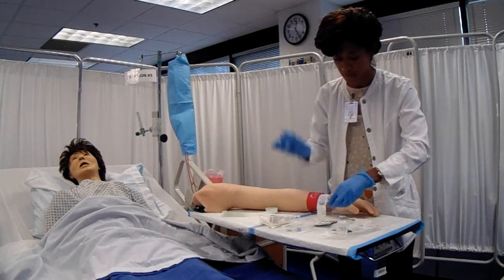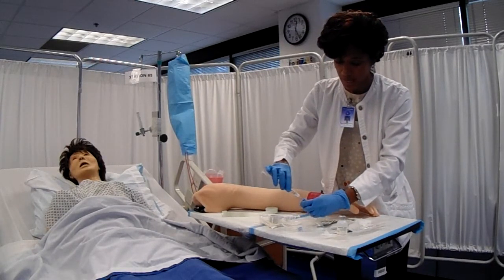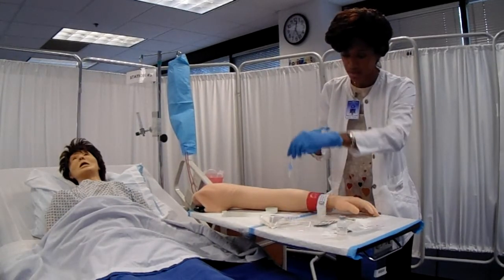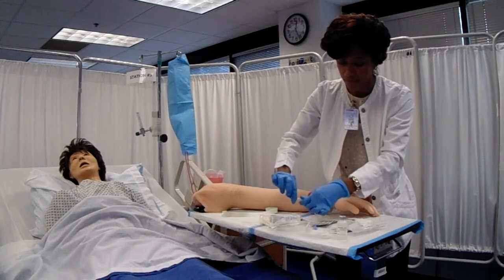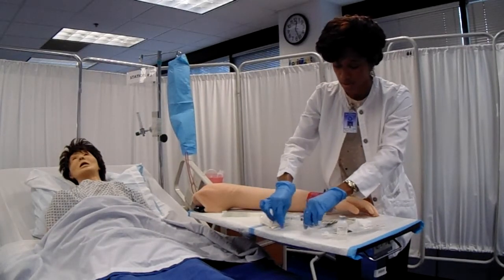Now I'm going to connect my flush to my tubing. Again, making sure not to touch the tip of the tubing. And I'm going to flush for patency and to make sure that it's completely primed. I'll then loosen the cap at the end of my tubing to assist with application.